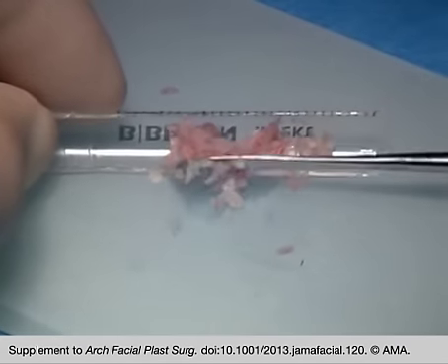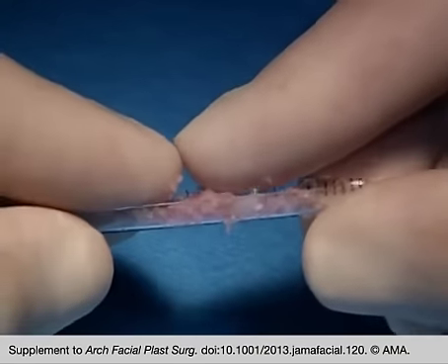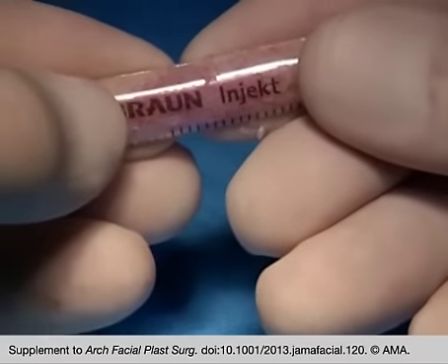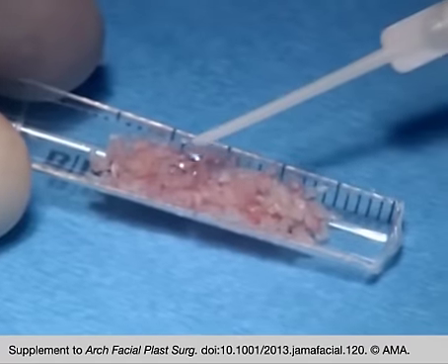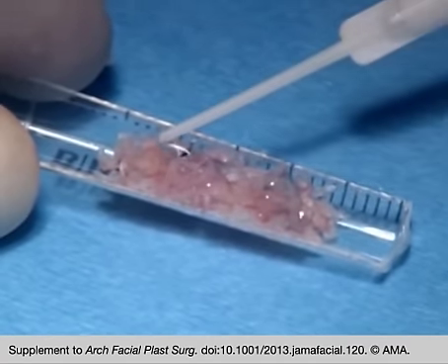The cartilage is then mounted to the mold and compressed with both index fingers to reduce dead space. A few drops of the viscous component containing the fibrinogen are added.